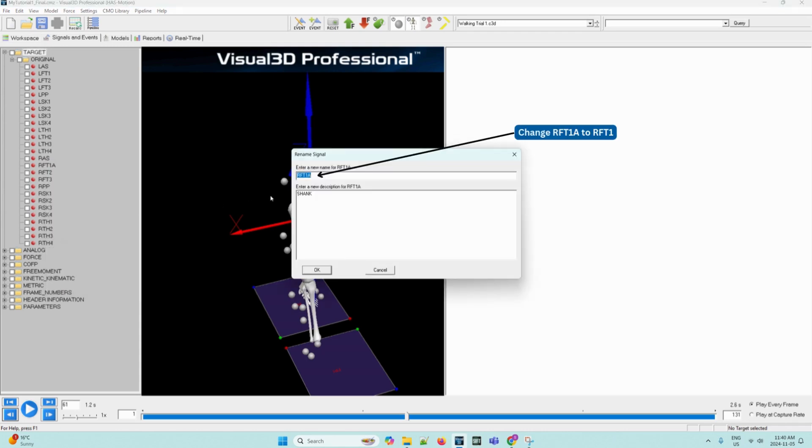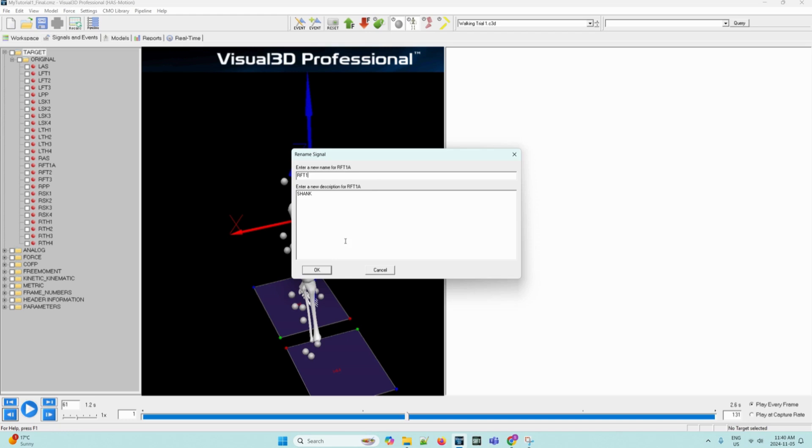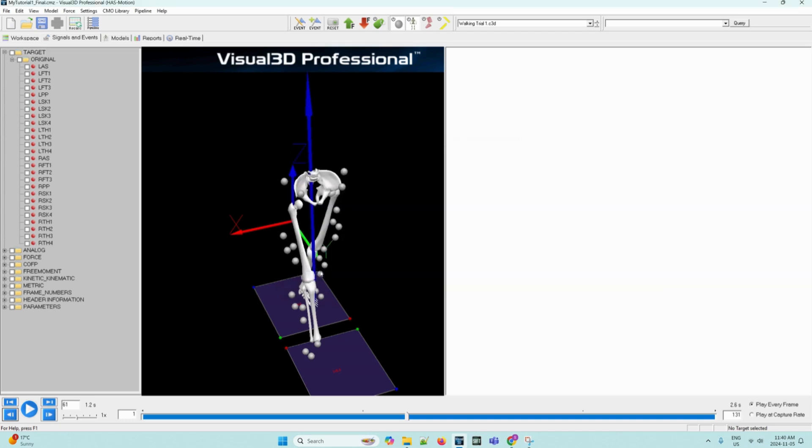In the Rename Signals dialog box, we can enter RFT1 within the Enter a New Name box. This will be the new name for RFT1A. This new name matches what is in the model file and solves the problem which did not allow the foot to be displayed. We can click OK.